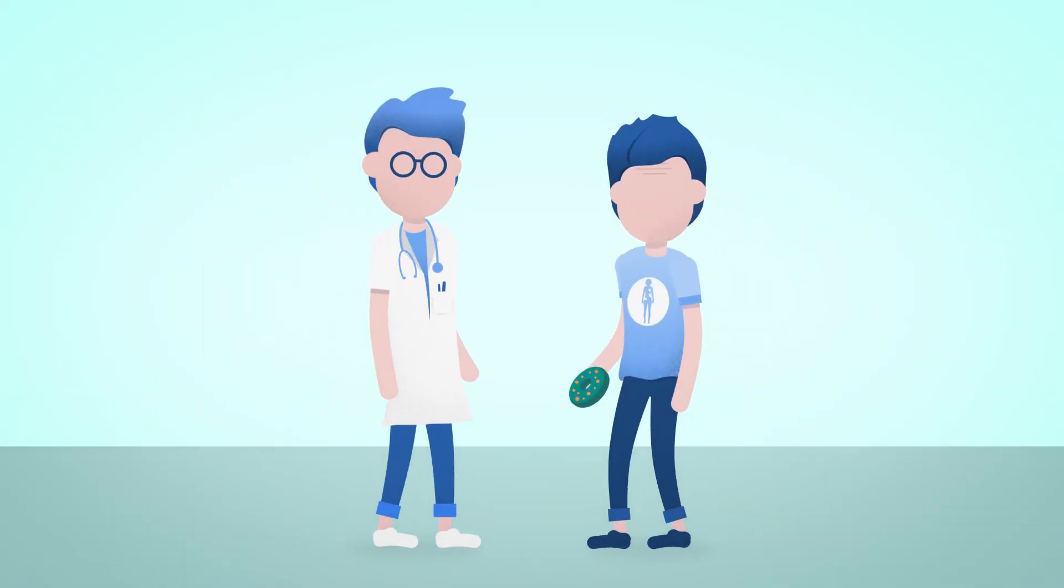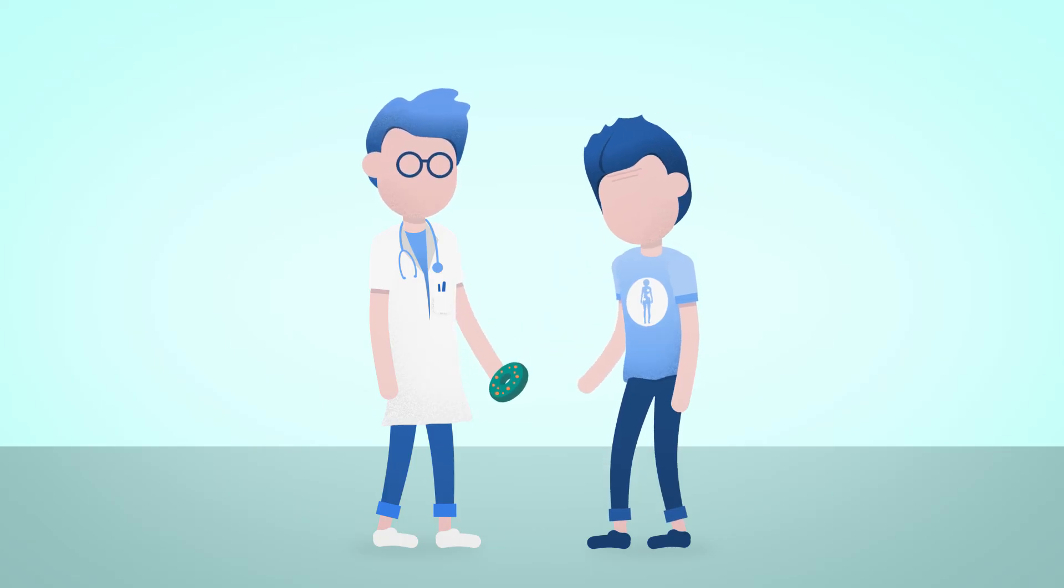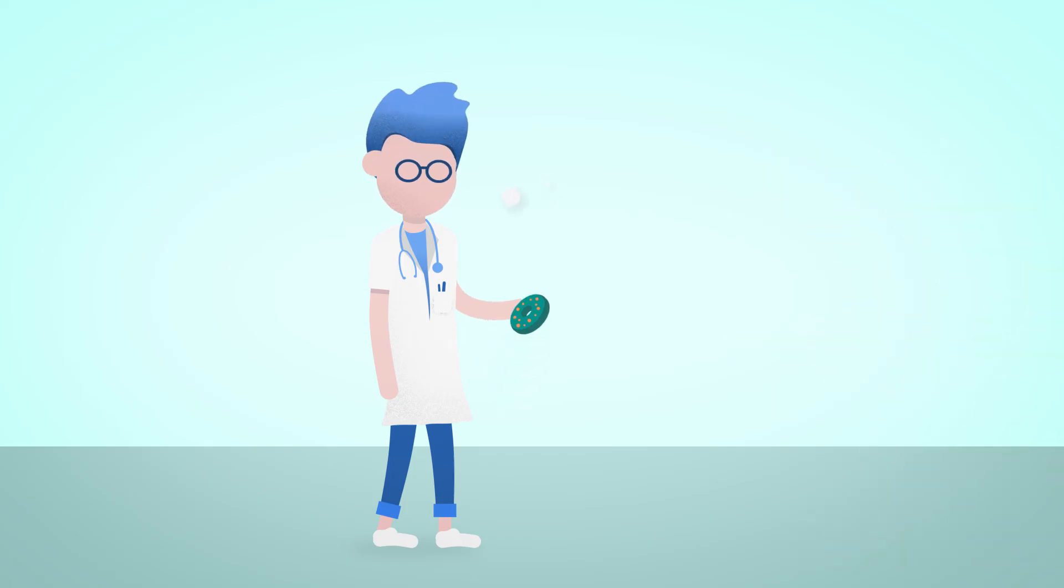Hank received some good news. He does not have lung cancer. However, Dame pointed Dr. De Vries to minor calcifications in Hank's arteries. So Hank must change his diet a bit.